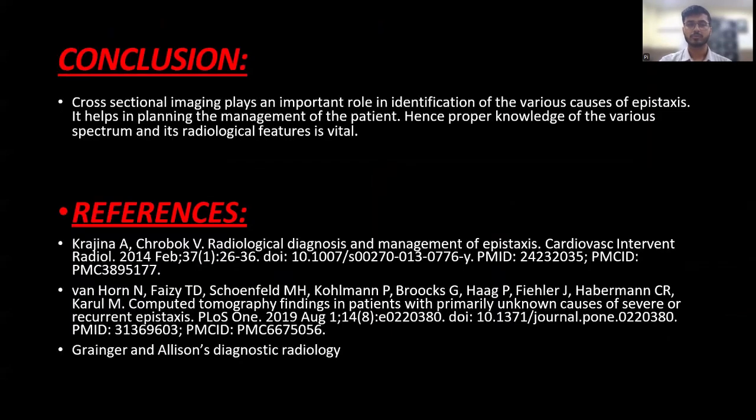So in conclusion, cross-sectional imaging plays an important role in identification of the various causes of epistaxis. It helps in planning the management of the patient. Hence, proper knowledge of the various spectrum and its radiological features is vital.